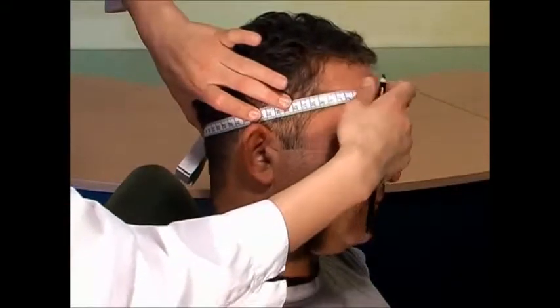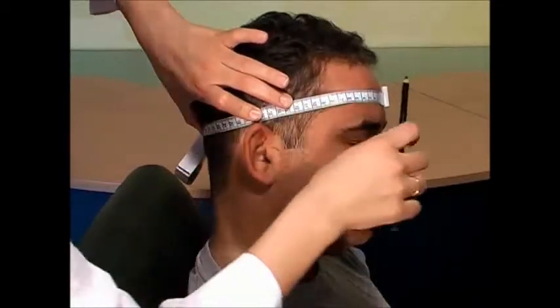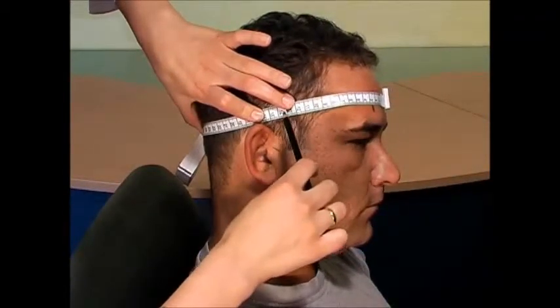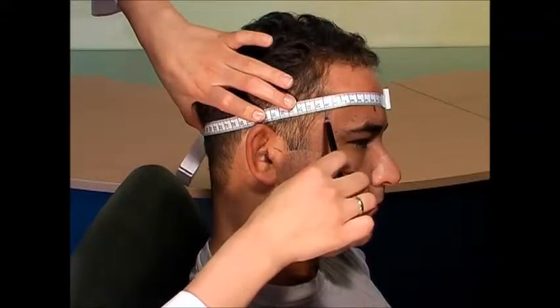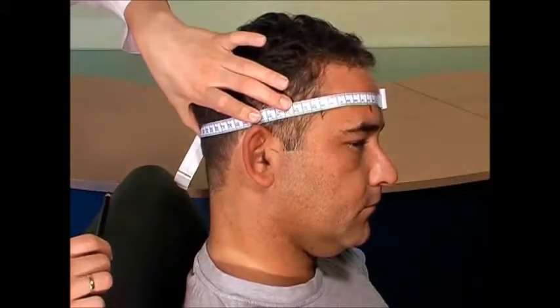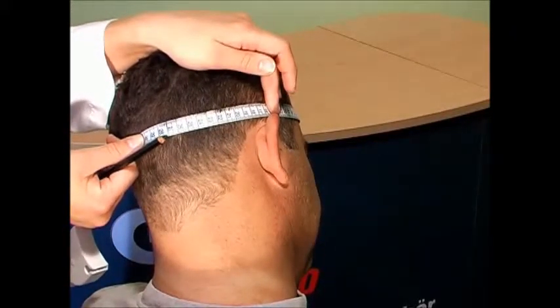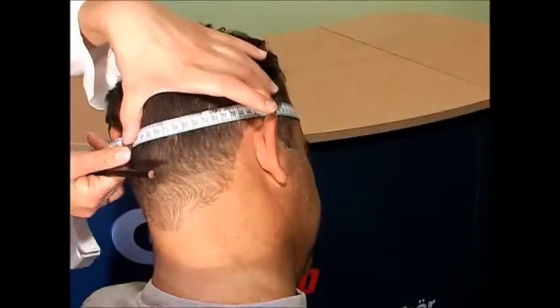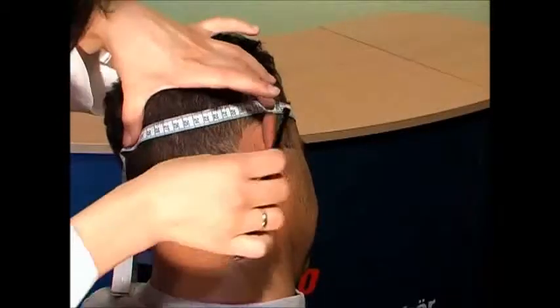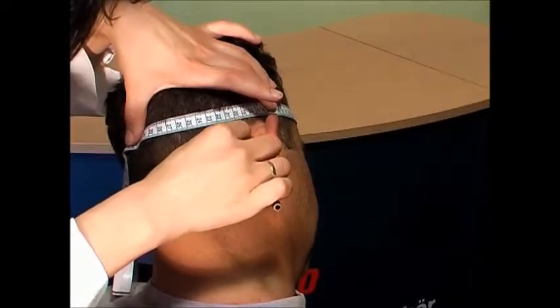Make the final mark for T4 at the halfway point of the distance from N to OZ. Mark Fp2 at 10% of the distance from N, and F8 at 20% of the distance from T4 towards N. Make the final mark for O2 at 10% from OZ, and lastly mark T6 at 20% of the distance from T4 towards OZ.